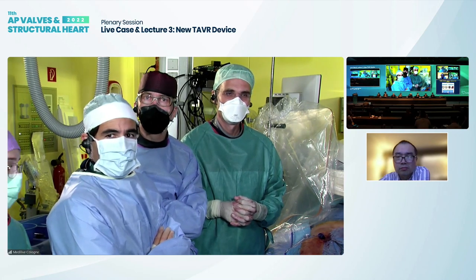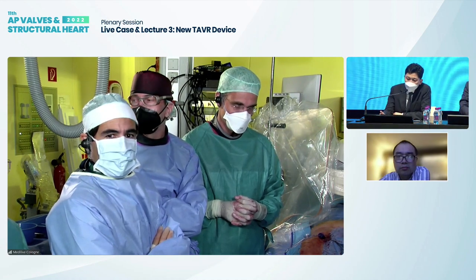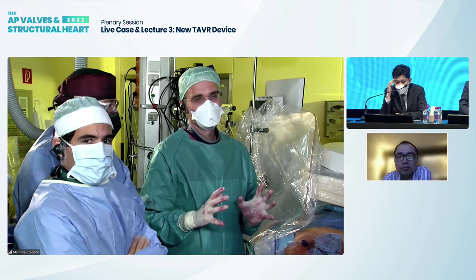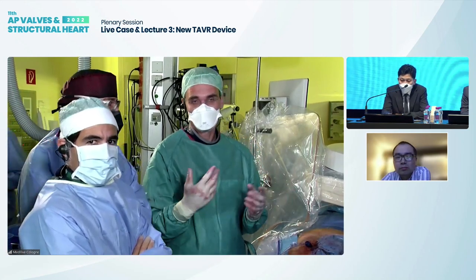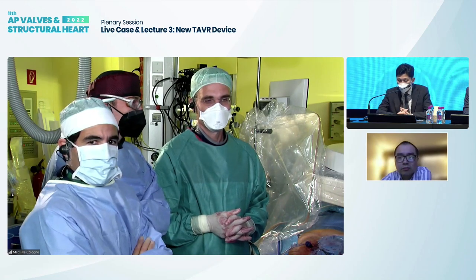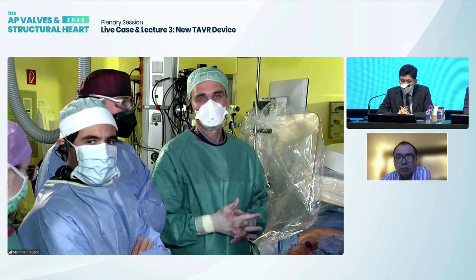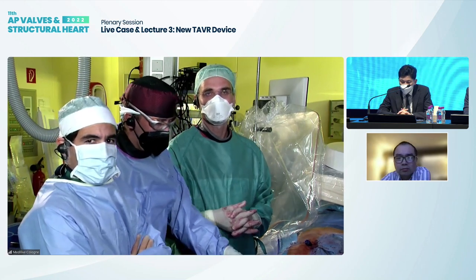Any question? Stefan, I'm that come from Seoul. I have a question: can the valve be applied to the patient with AR with prolapsed valve or annuloectasia? Is it possible? Yeah. So the anatomic conditions and prerequisites are quite narrow. We are looking at the steepness of the arch. We are looking at indeed also the extent of dilatation of the ascending aorta. We did some patients with aortic aneurysms, which can be done, but this is outside the current clear indication. So we have to be a little bit careful here that we are able, and this is most important, to maneuver the valve into the position and locate the locators in the cusps. Therefore, with the current system at least, we need some prerequisites with respect to the anatomic situation.